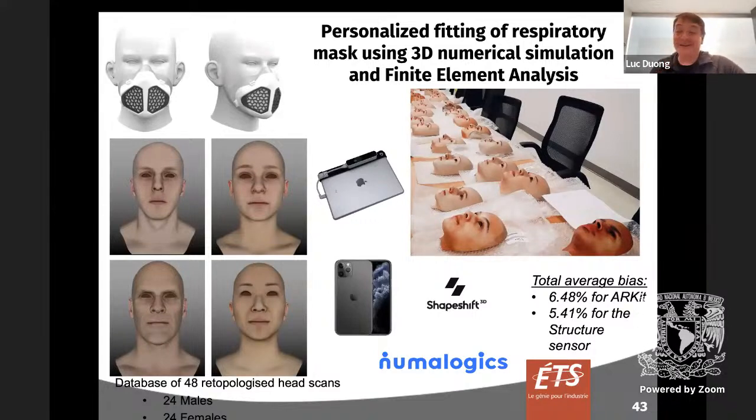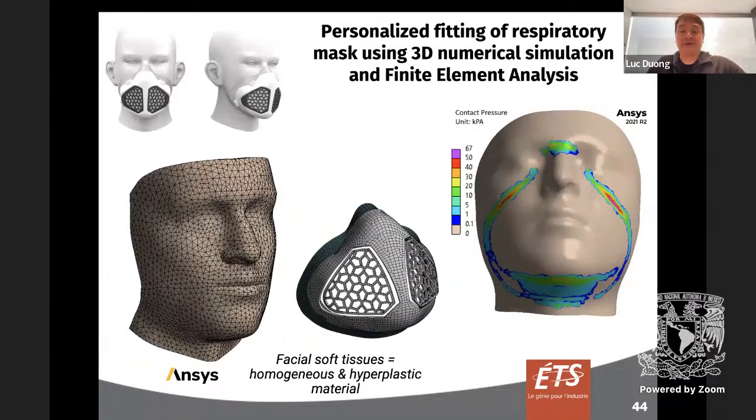We did some work also on respiratory masks. We did some 3D simulation using finite element analysis and machine learning. And we had one project where we took a lot of virtual models from the computer game industry. We bought a database of faces that are used in 3D games, and we printed them in 3D to validate our approach using the respiratory mask. So we could test it on different morphologies, anatomies, old, new, different ethnicities, and so on. It's very important to do that, I think, to really capture the large amount of data that we have when we're dealing with personalized human models.